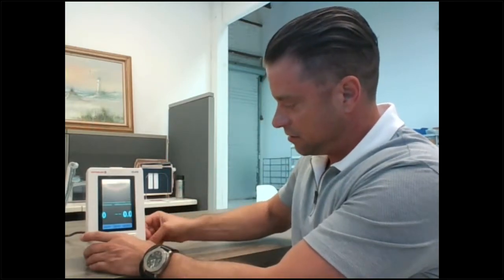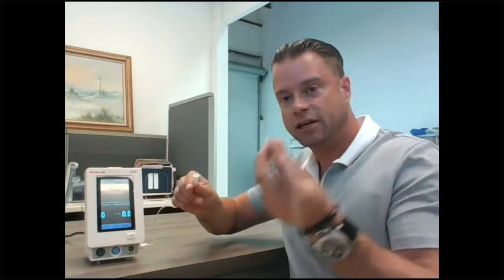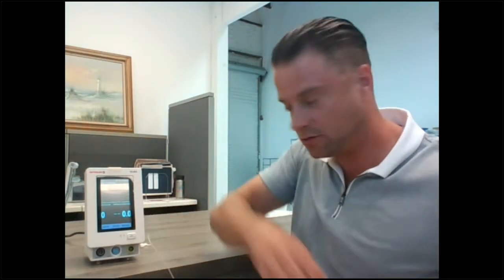This is a Nafion filter. Plug the Nafion filter onto the luer lock like so. Then you can take your nasal cannula or sample line and twist it onto the filter.